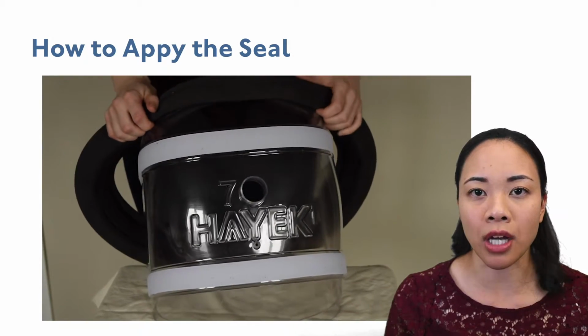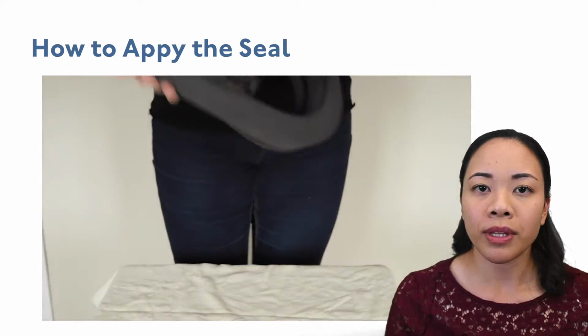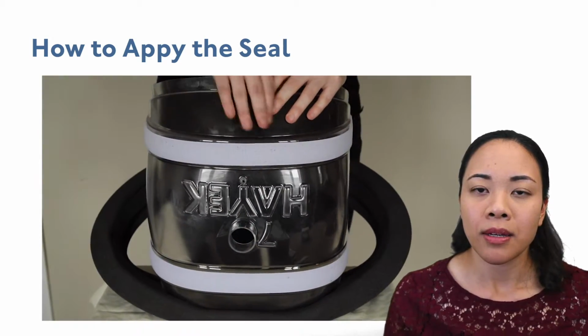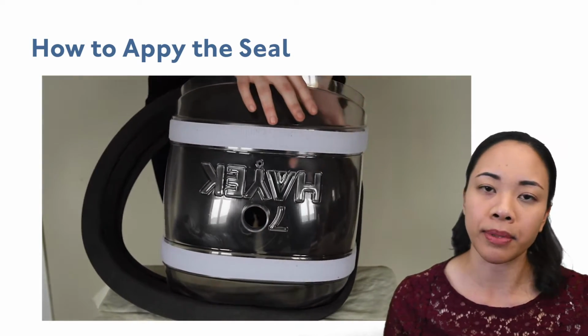Step 2. Starting from the center top ridge, begin to attach the seal to the top groove. When the seal fits the top groove, turn the Cuirass upside down. Position the seal between the Cuirass and a solid surface to hold it in place.